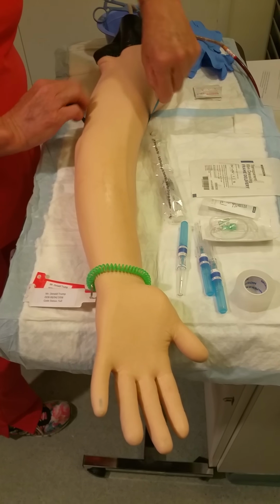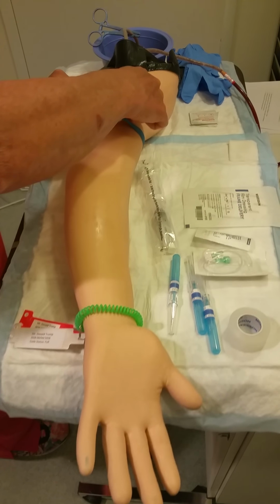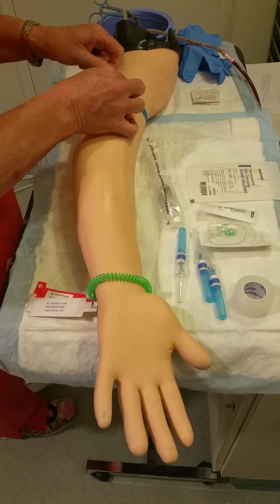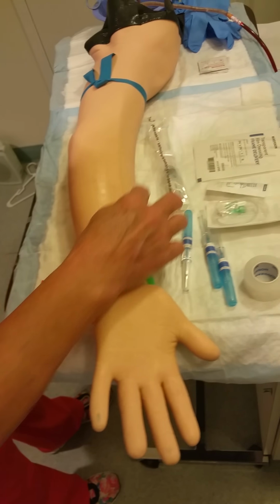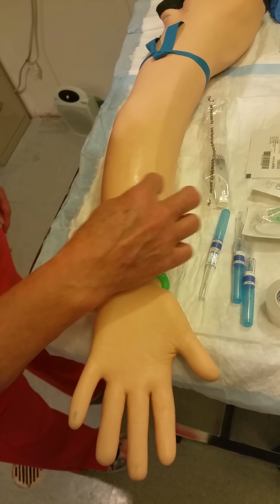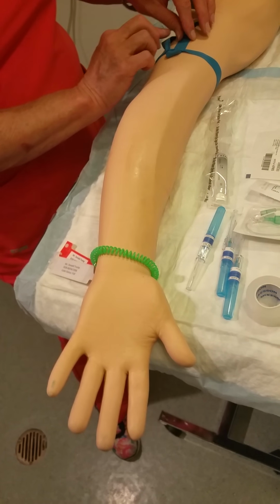The first thing I'll do is place the tourniquet above the venipuncture site, of course. Now this is going to be tight. And we use the tourniquet to engorge the veins and choose an appropriate site, and I see a vein engorging here. Would it be all right if I start your IV in this area? Yes. Thank you, Mr. Trump.